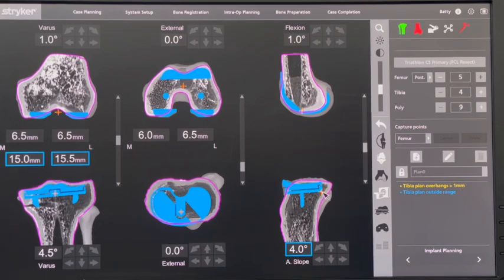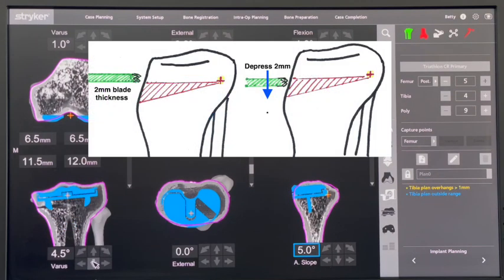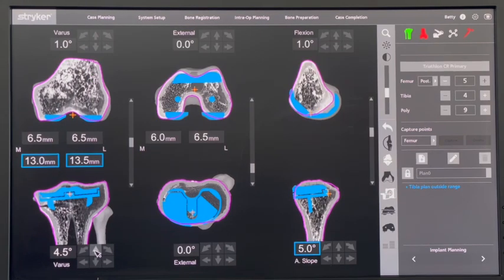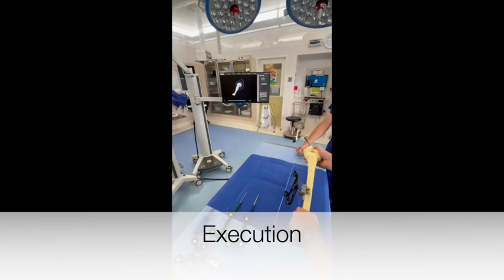Having confirmed our hinge point and plane of the first cut, we rotate our tibial implant 14 degrees for the second cut, resulting in a 10-degree closing wedge. The 2 mm width of the saw blade must be accounted for. The superior cut is dropped down by 2 mm as illustrated. Once this is performed, the base plate is re-elevated before rotating around the hinge point to set the second plane as shown. Pins and arrays are placed and the hip center is confirmed.